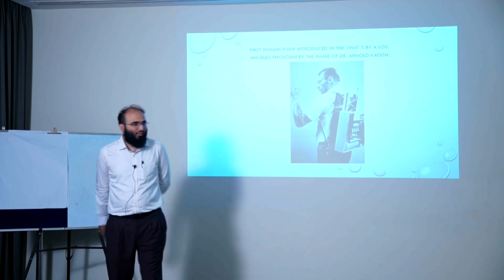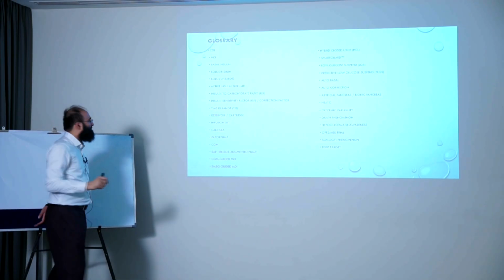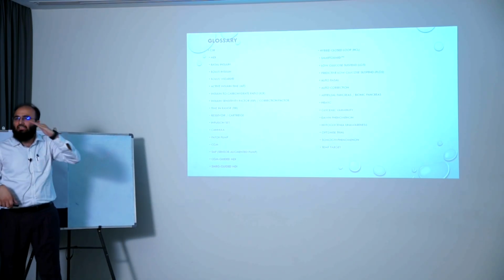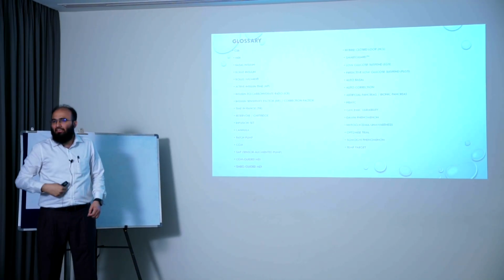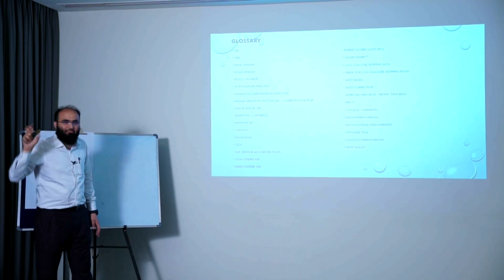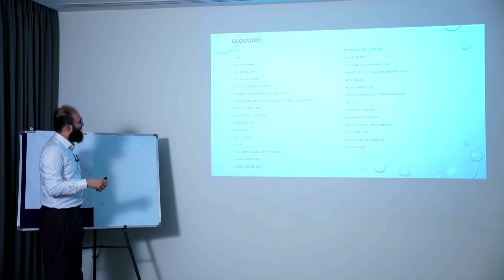So for this, I want to take you to the next slide where I am talking about a few glossary terms. I'll just get them for your reference. CSII is continuous subcutaneous insulin infusion. That is technically what the pump is doing. MDI is multiple daily injections of an insulin. So some patient is taking 3 boluses, 1 basal. That's MDI. Basal insulin is the long-acting insulin that we give. Bolus insulin is the rapid-acting or the short-acting insulin that we use.